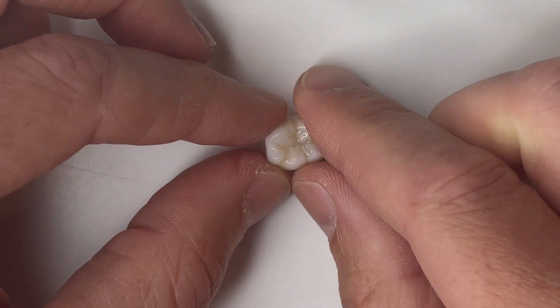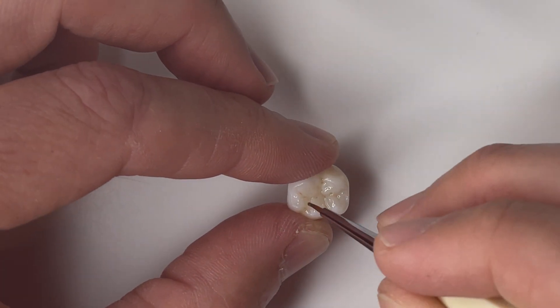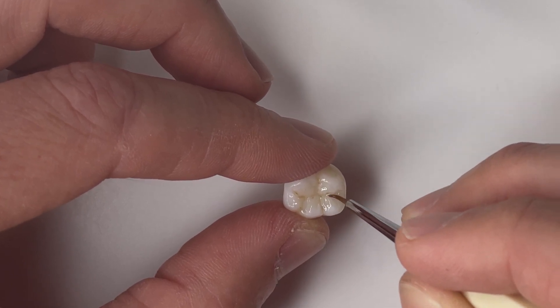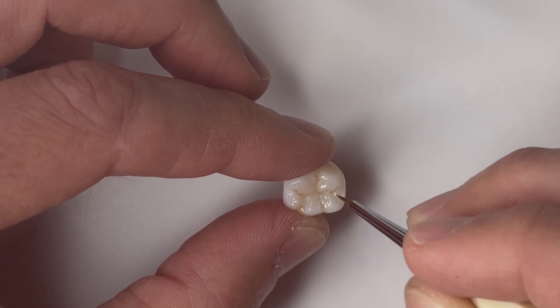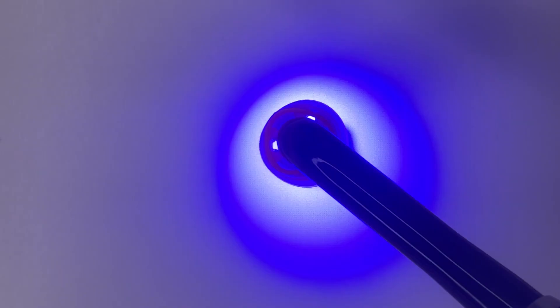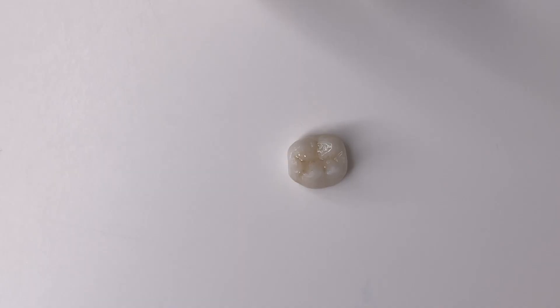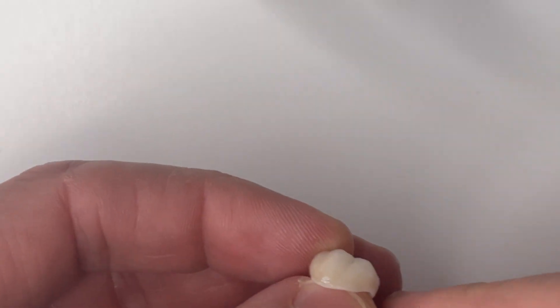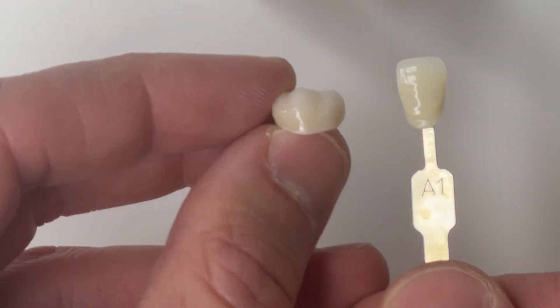Keep in mind that at the very end we're going to add a layer of glaze, and that glaze will be the same resin we used to print our restoration — in this case Bleach Flexera. I'll show you at the very end how we put a nice durable coat over our stains to make sure they are locked in and don't wear away. Whether using this as a temporary or a definitive restoration, this is a really good way to stain these restorations.